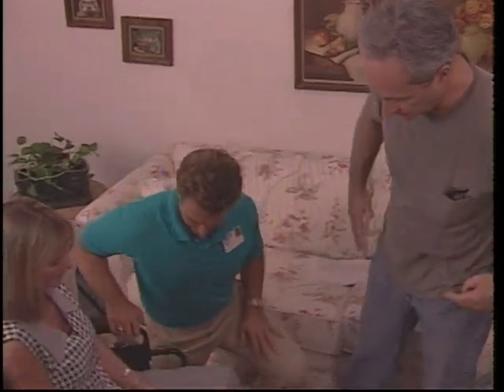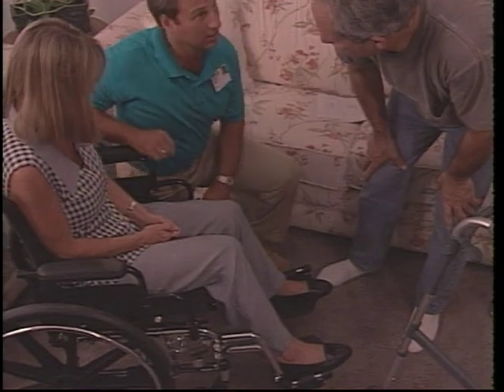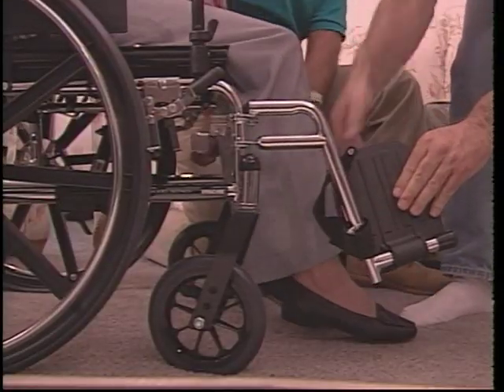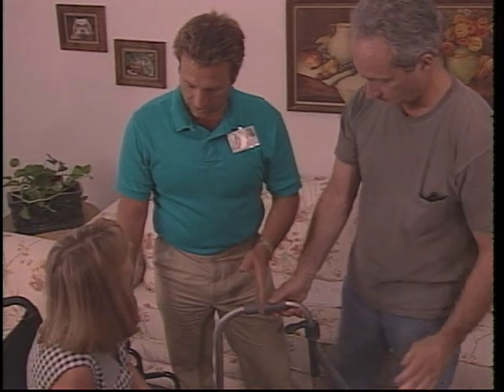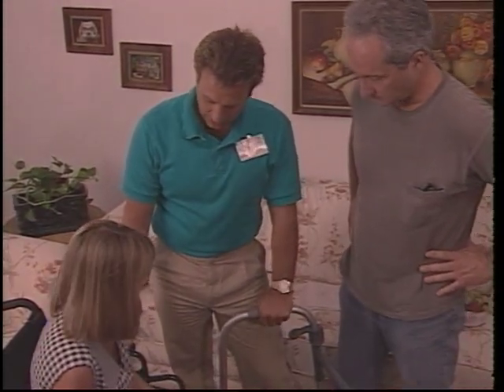Now, whenever you're transferring from the wheelchair, first thing you want to do is engage both wheel locks, all right? All right, then we'll get the footrests up and out of the way. There you go. Okay, bring the walker in. Always keep your walking aid near or close to your bed or your chair so you have an immediate means of support, okay? All right, let's say you do the transfer. You remember how to do it?